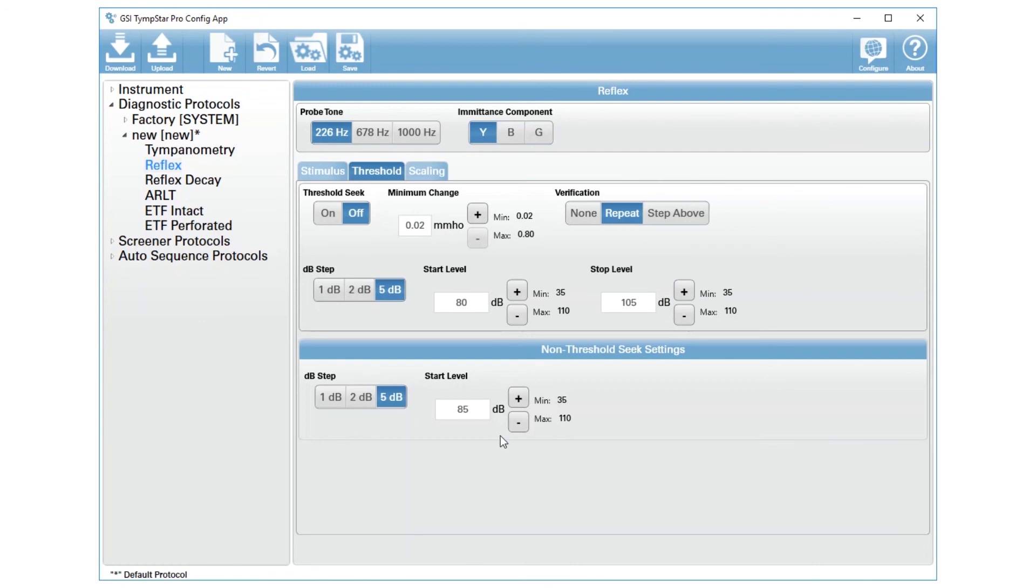When you have these selected, you can go through and make other changes to this protocol. If you're done, you can press download. That will send this protocol back into your TempStar Pro. Simply press Data Erase Clear Session and the new settings will be applied.